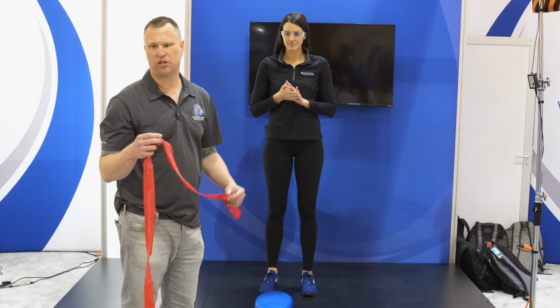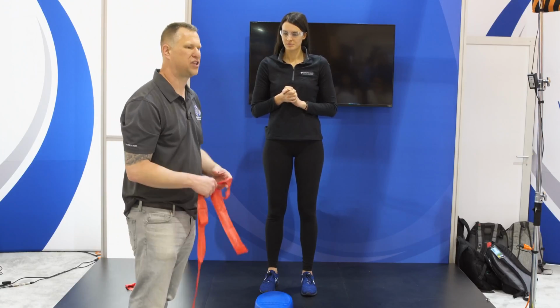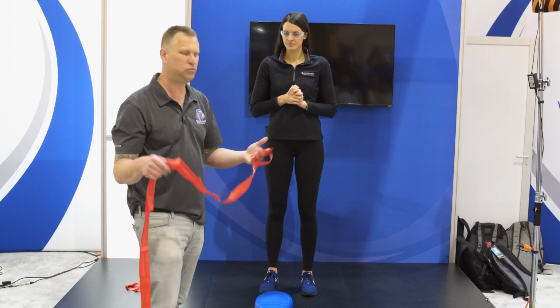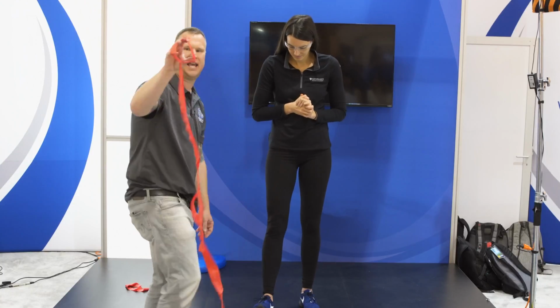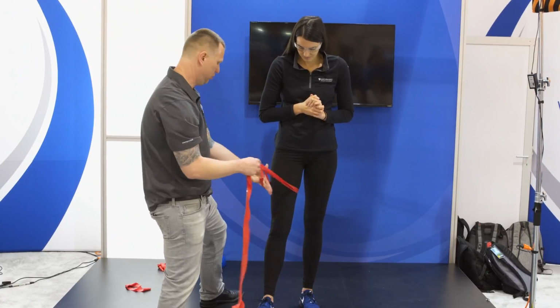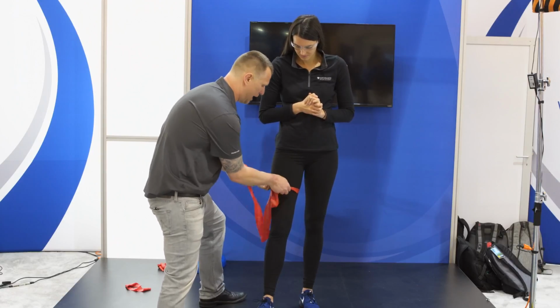Now the last thing I want to show you guys today is how we can bring multi-plane strengthening in, utilizing the CLX. So when we're talking about multi-plane, we're talking about forces that are going in 360 degrees. And what we can do is what we call loop training. So I'm going to have her come forward, and I'm simply going to take that loop of that CLX, guys. I'm going to come in and around the leg, and I'm going to bring that band through the loop. Again, something not easily done with a traditional flat band.